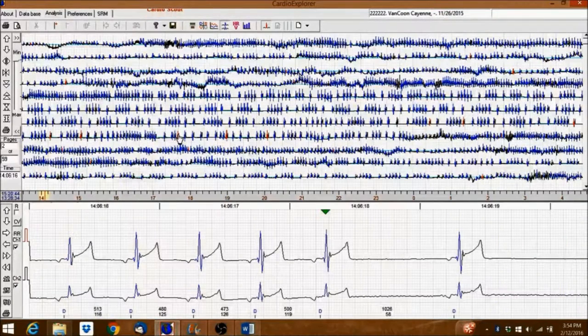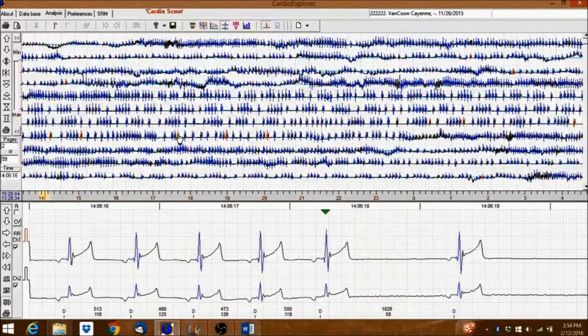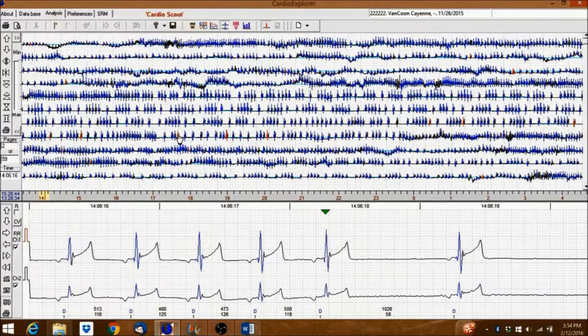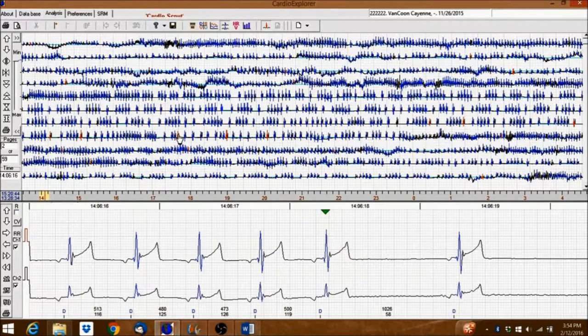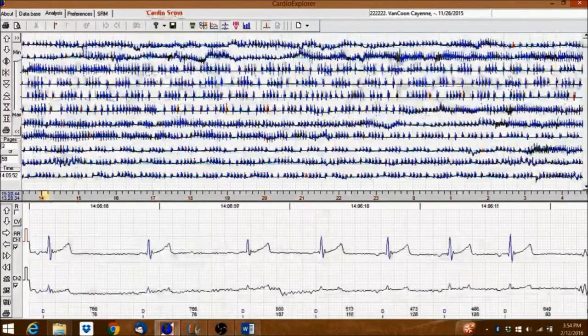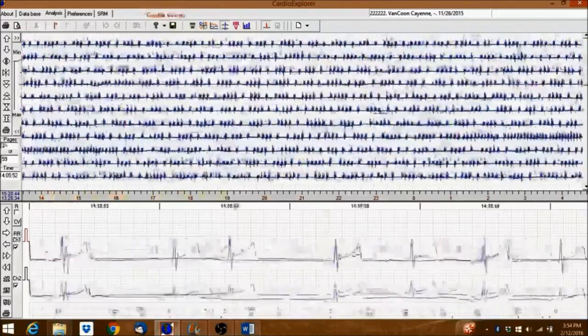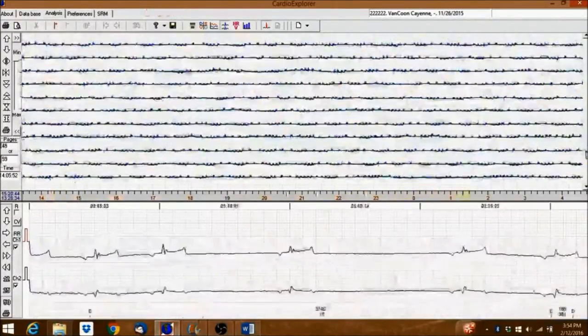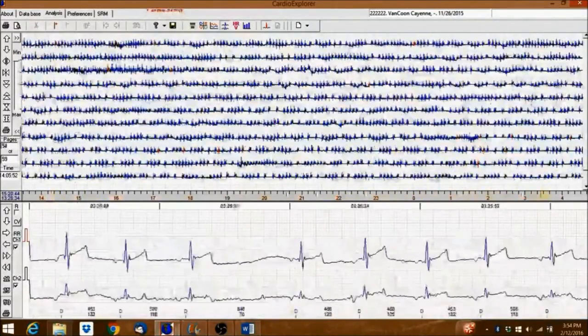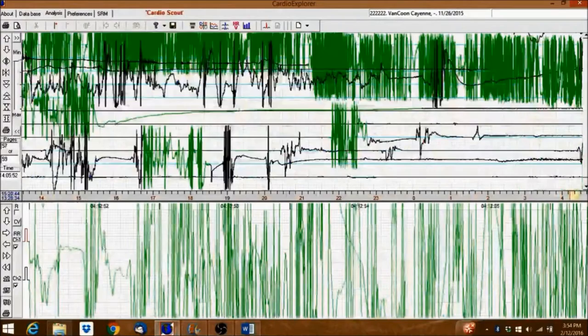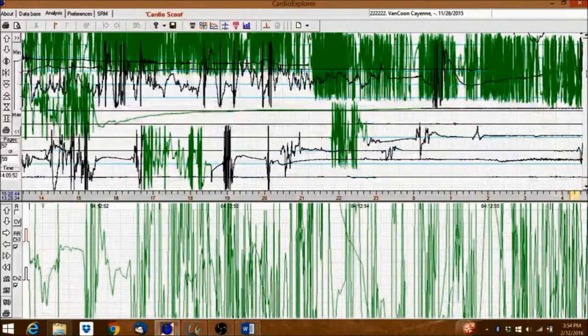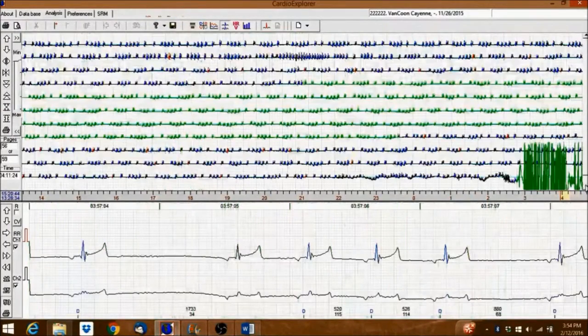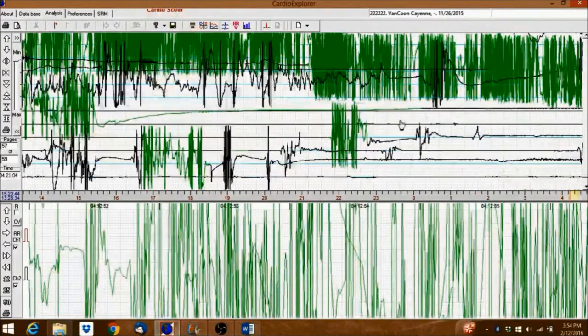The parts of the recording the software considers poor in quality will automatically be highlighted green. Let's scroll to find them now. Please note, the sections of the recording marked green will not be analyzed nor will they be included in the statistics.